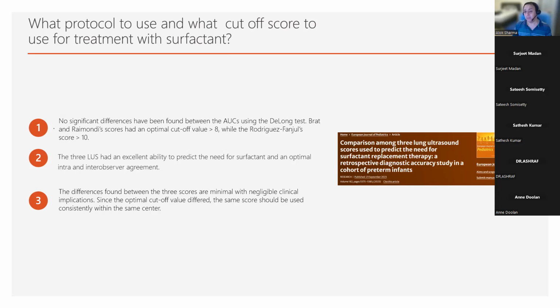And in particular, for the extremely preterm babies, my argument would be that if you're going to move these babies and you want to analyze the posterior regions properly, then that can be a lot of handling, opening of doors, a longer scan, a lot of insensible fluid loss, which can make these babies quite unwell.